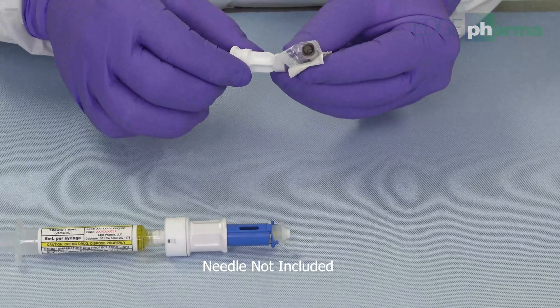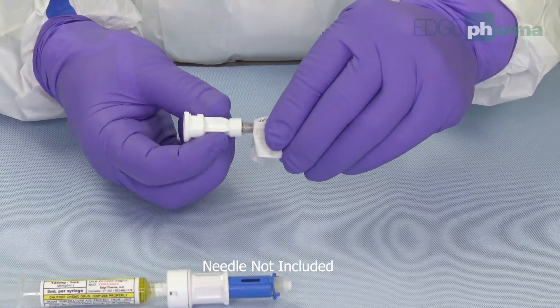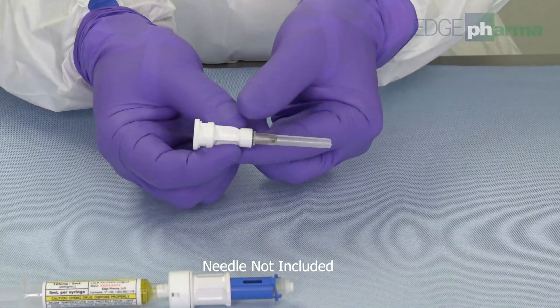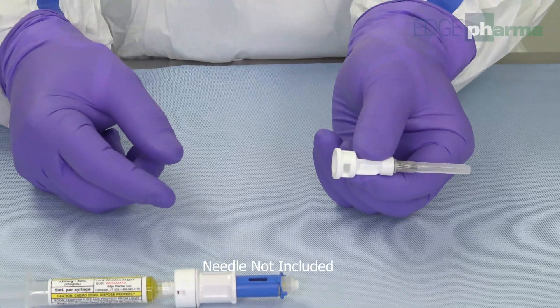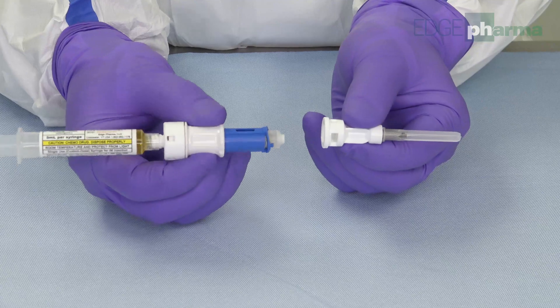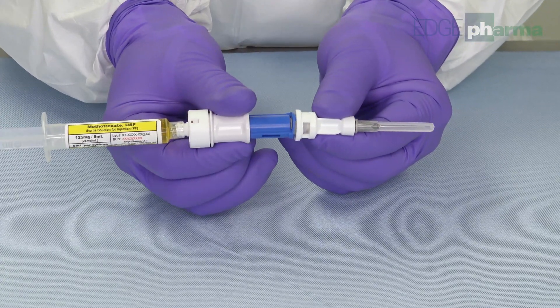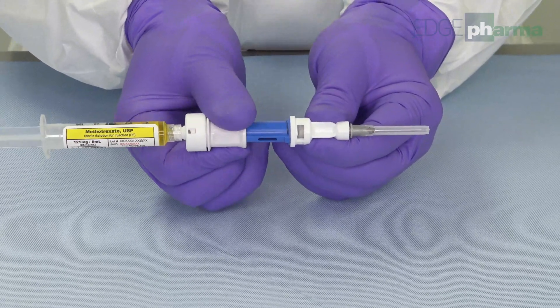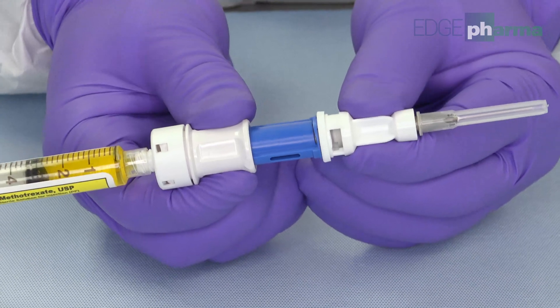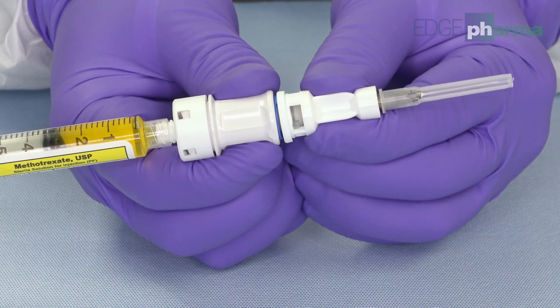Affix the luer lock adapter and needle to the closed system transfer device. Engage the closed system transfer device. You are now ready to administer the dose.